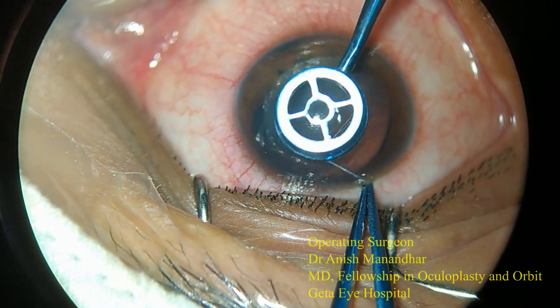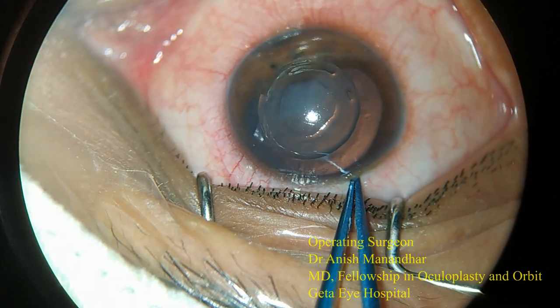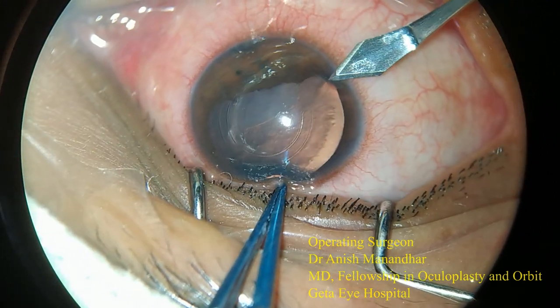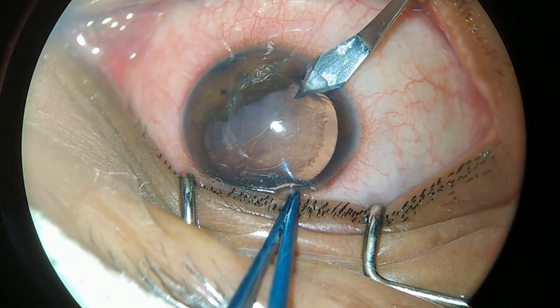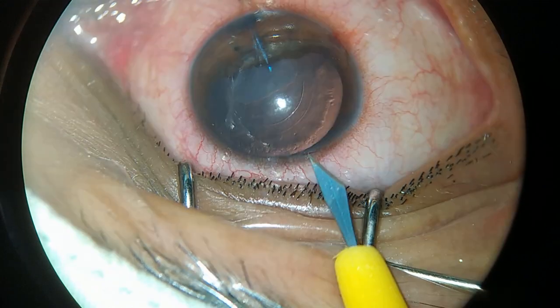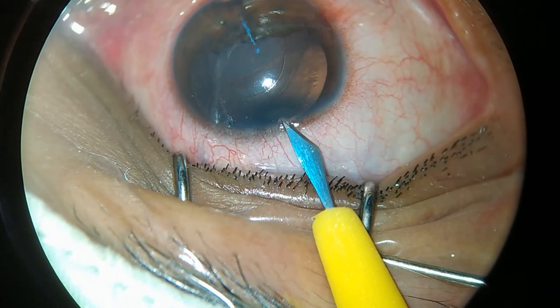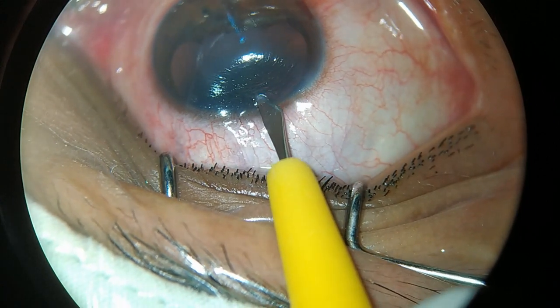The patient has opted for an extended depth of focus IOL, so we used a rhexis marker for accurate rhexis centration and size. Most of the steps in the surgery, such as incisions and capsule staining, are routine.